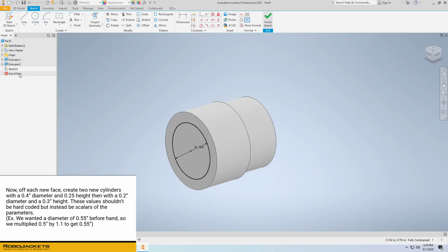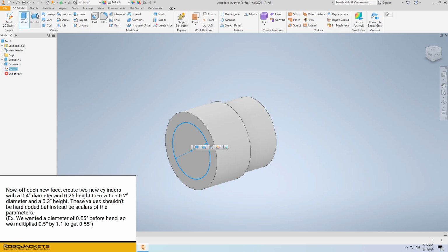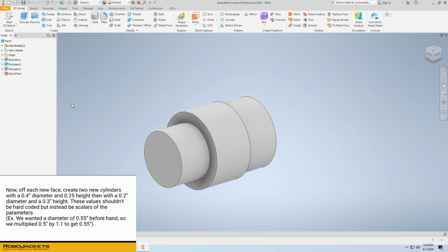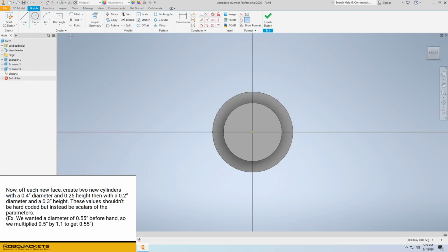Finish this sketch and extrude it. The current value should be 0.25, and because main thickness is also 0.25, we can simply say that this is main thick. And then once again, we'll do that process off of the new cylinder, creating another circle. This one is 0.2 in diameter, and with an original diameter of 0.5, it means this is 40% of main diameter. So, times 0.4.